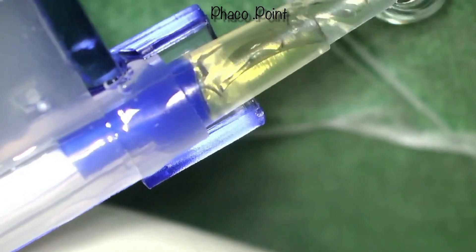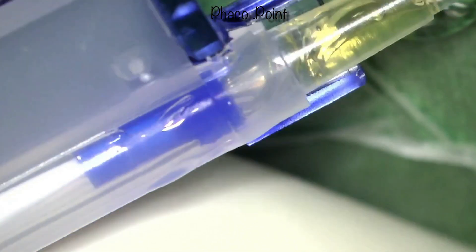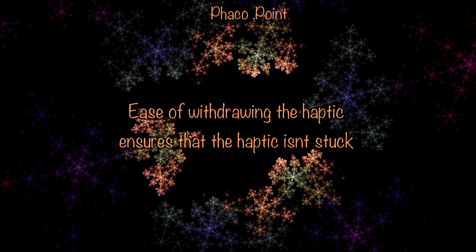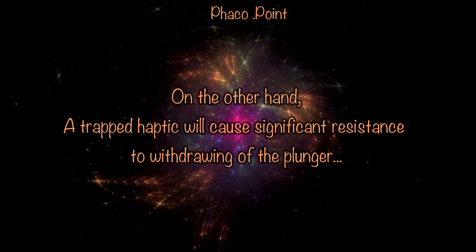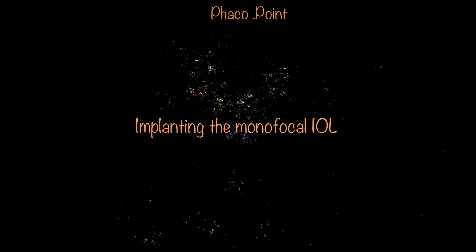The other thing I do to check and ensure the haptic is not accidentally trapped is that when I bring the IOL up to the tip, I always do so under the microscope under direct visualization. Upon bringing the IOL up to the tip, I always withdraw the plunger only slightly to ensure it moves away comfortably and that there is no trapped haptic between the plunger and the cartridge. Should there be accidental trapping, the plunger will not withdraw easily — in fact, the entire IOL will try to move back and you will feel significant resistance. Once you have ensured there is no trapping, it is safe to inject the IOL.